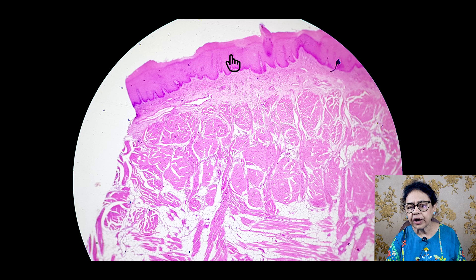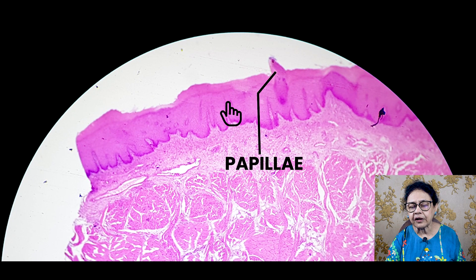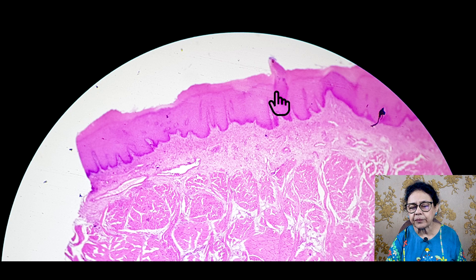Now why is it tongue? You should see that there is a papilla. Over the tongue there is a papilla you will see. This is the papilla which is known as the filiform papilla.